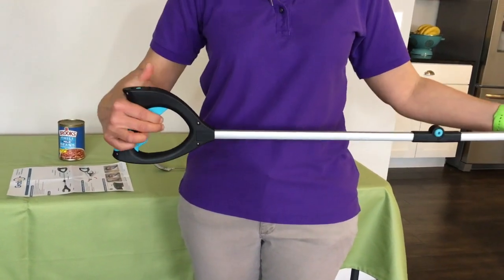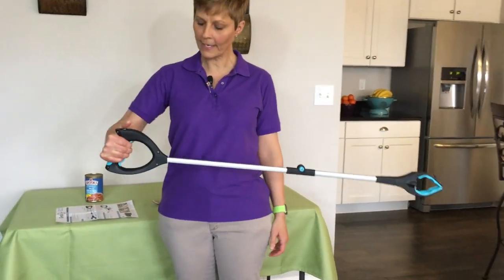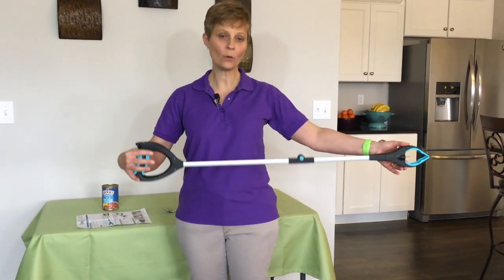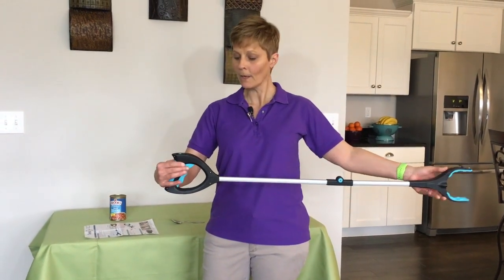So it's either a standard grip on the end of this reacher that you maintain the grip down here, or it's a ratcheting where you grip here, it ratchets closed and holds itself closed. So we're going to demonstrate a few of these features right now.